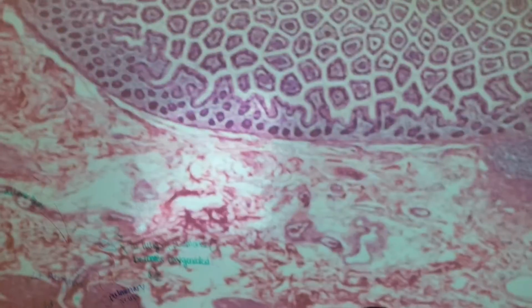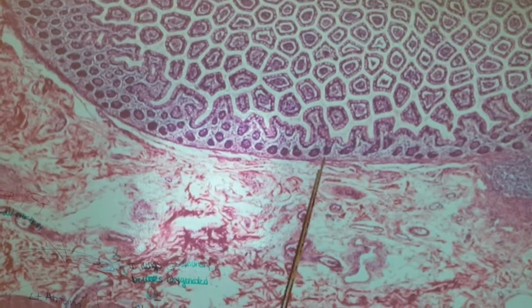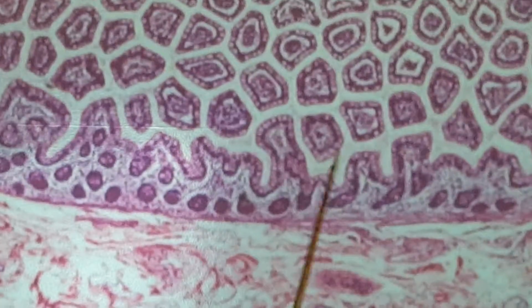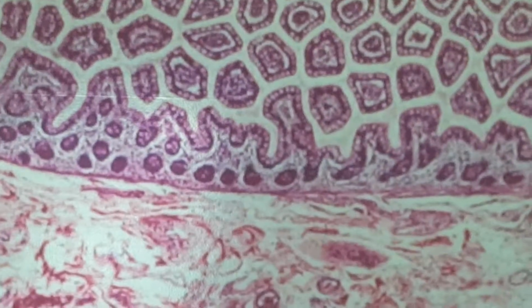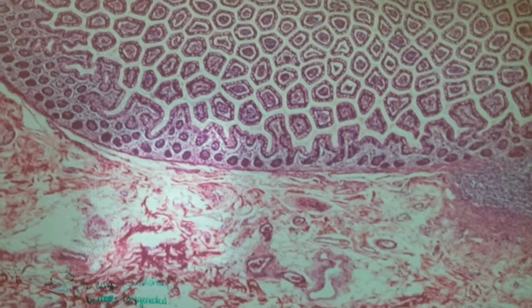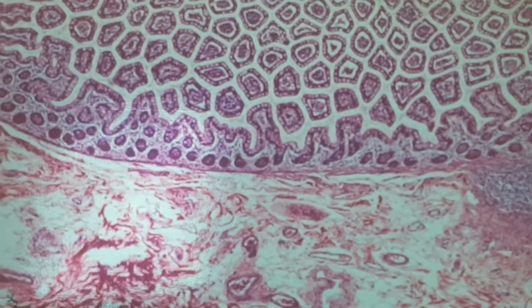All right, so in this, again, we would look at something that's still attached, for the point of projection. So the villus would still be attached to the actual lining rather than out here. Now in this one, I can see a lot of goblet cells showing up there. Very wavy. All right, moving on to the colon.